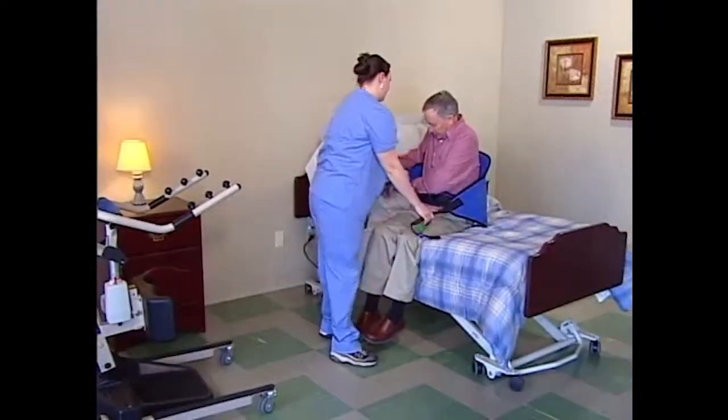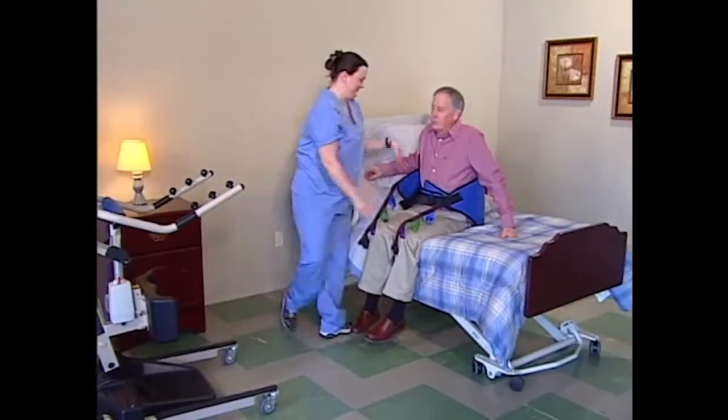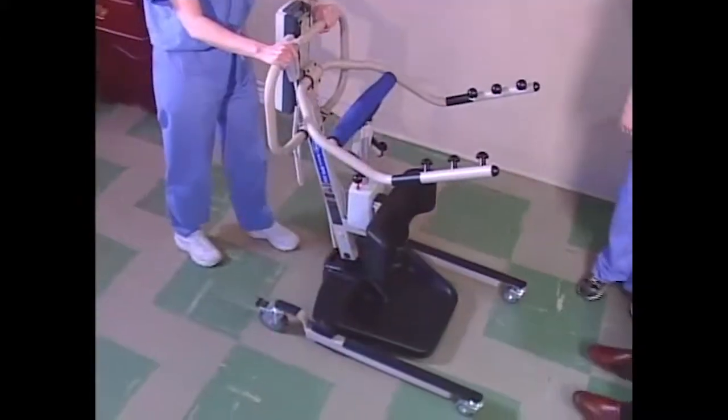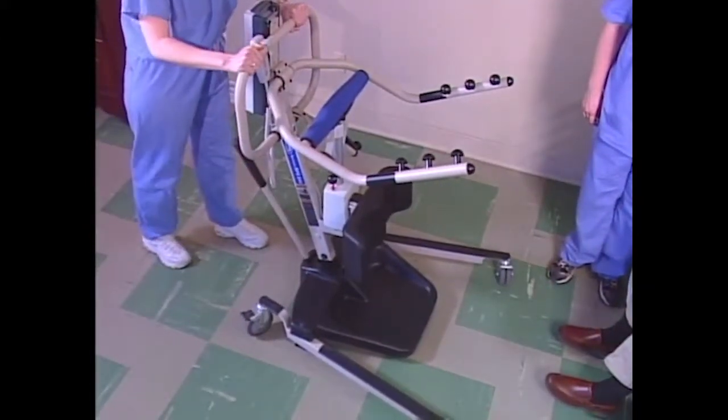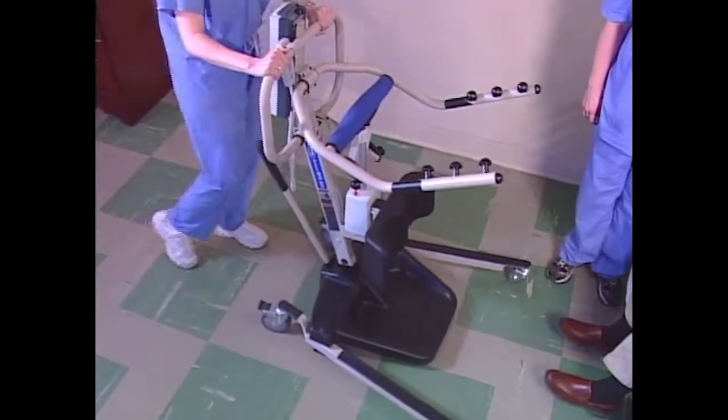Then, while one caregiver stays with the resident, the other moves the lift into position. To safely perform any lift, the lift legs must be in full open position. Explain to the resident that they need to place their feet flat on the footplate while you roll the lift into position.